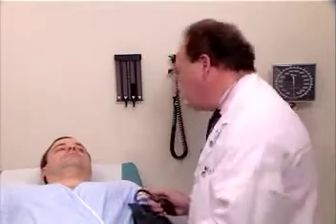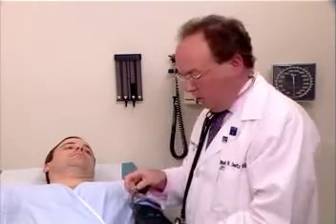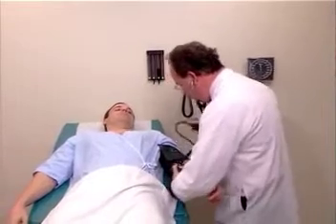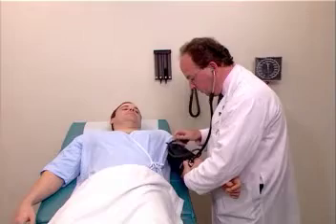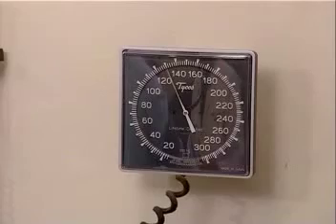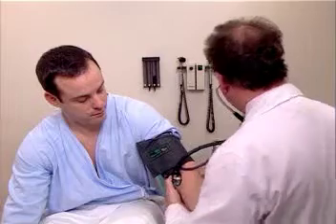The final assessment of blood pressure determination is orthostatic hypotension. I'm going to ask you, Mr. Johnson, to sit up rapidly when I tell you. Make sure that you are ready to determine blood pressure by having the set screw properly tightened. The set screw is tightened — please sit up for me now. Blood pressure is determined by pumping the cuff up about 20 millimeters above systolic, and we now record the systolic and diastolic blood pressures. If orthostatic hypotension were present, we would record a drop in the systolic blood pressure, as well as usually an increase in the heart rate. This concludes our blood pressure determinations.